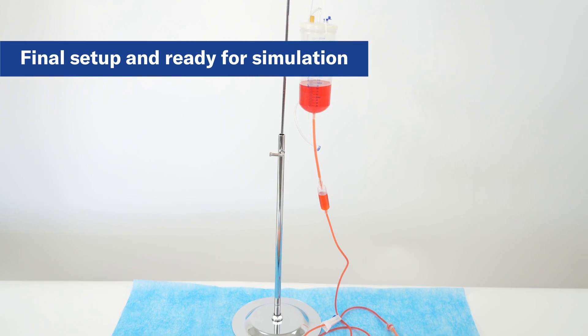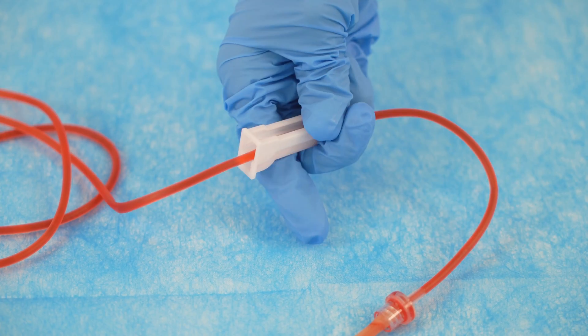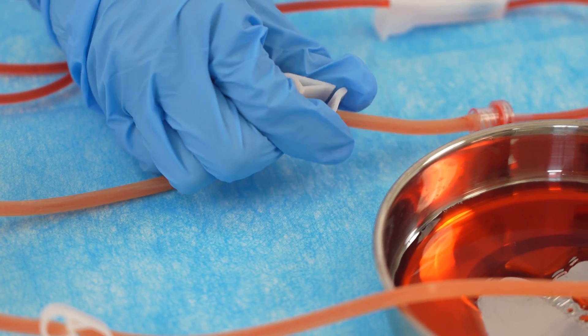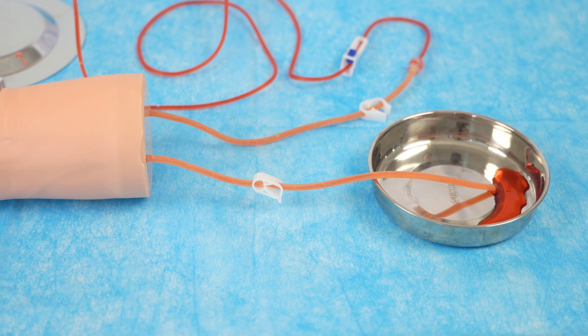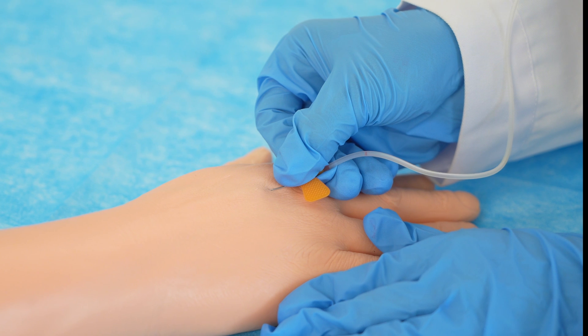The arm is now ready for use in phlebotomy simulation. Make sure that both the outflow roller clamp and the connector clamp on the arm's tube are open, while the clip clamp at the exit of the arm is closed. This will ensure that fluid is controlled during practice.